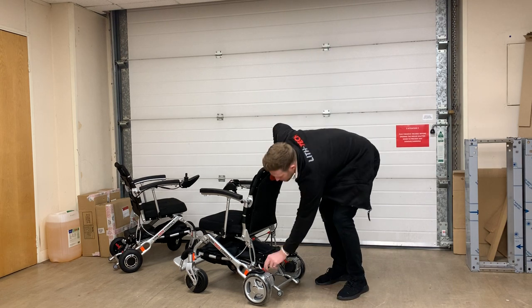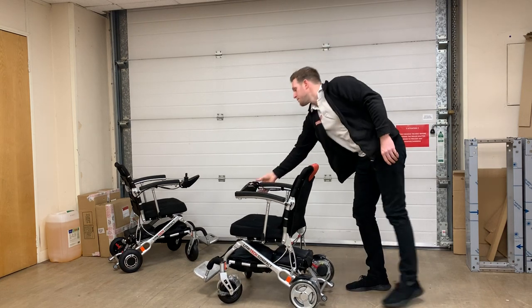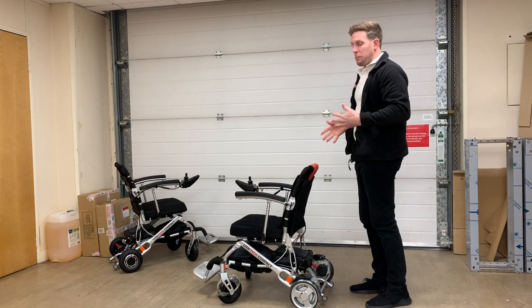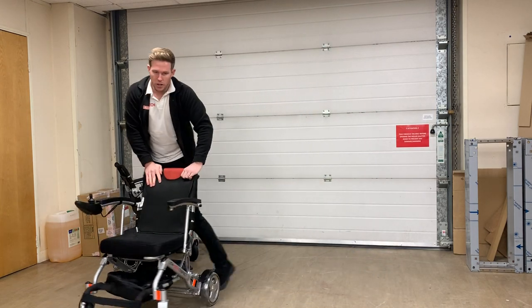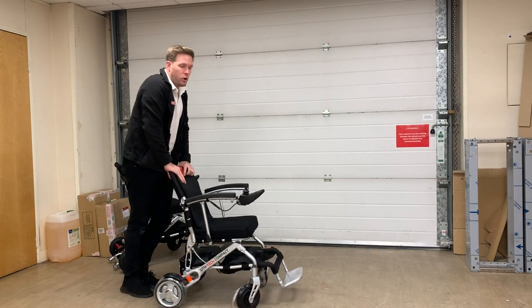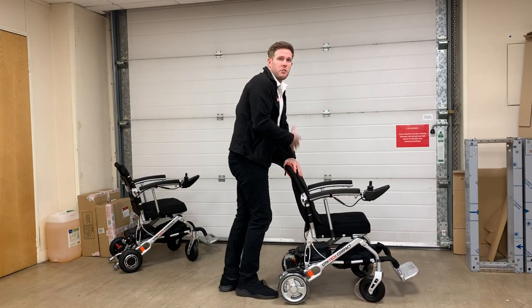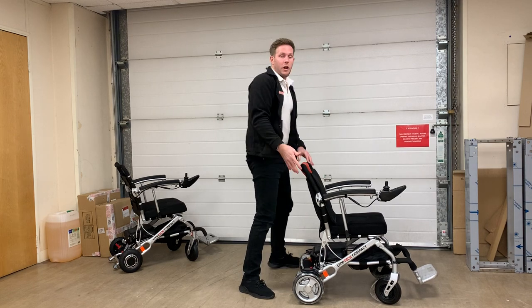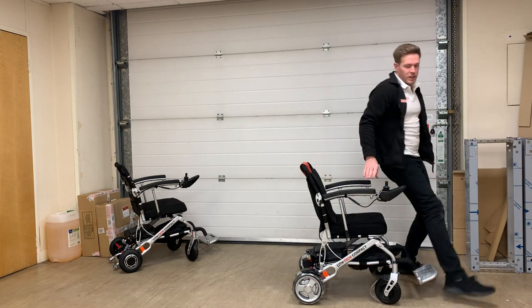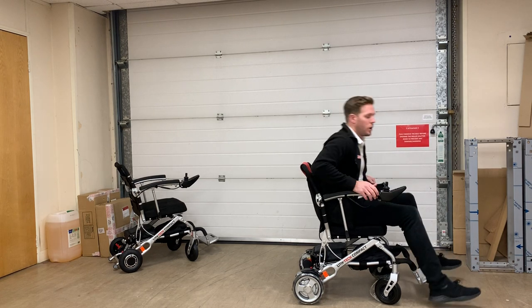A great feature of this chair is it can not only be used in electric mode but also in manual mode. It can be pushed very easily, and you can even use it as a stroller to get a bit of exercise. If you get tired after only a few minutes, you simply put the chair into electric mode, sit in it, and use the joystick as an electric wheelchair — so you get the best of both worlds.